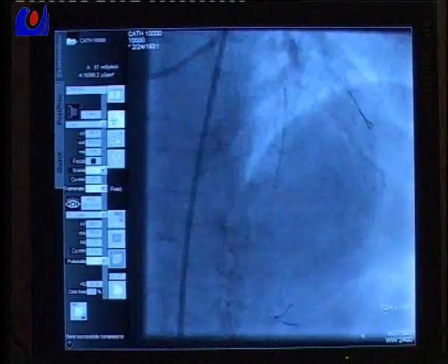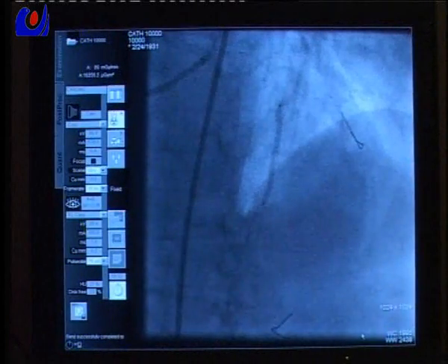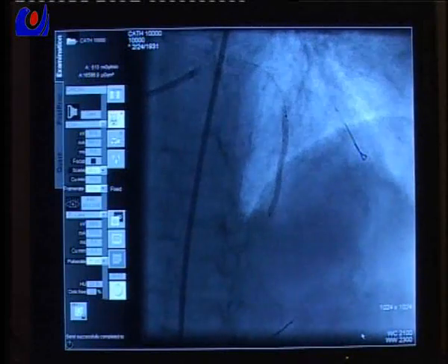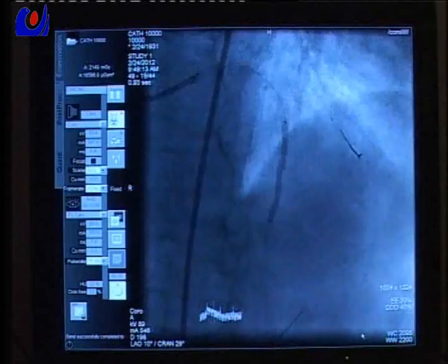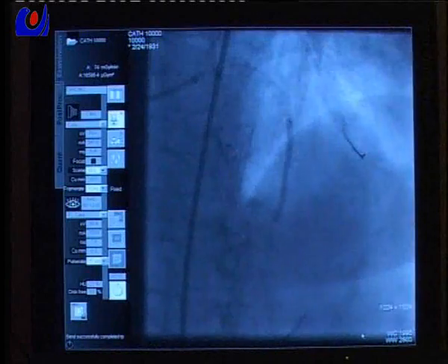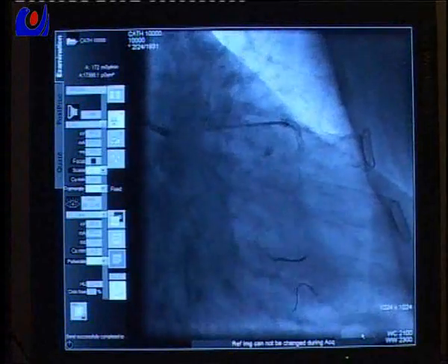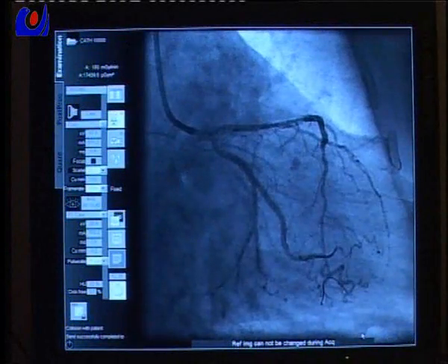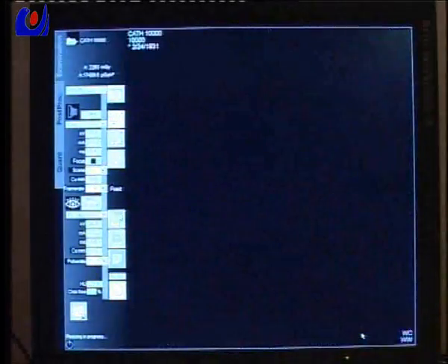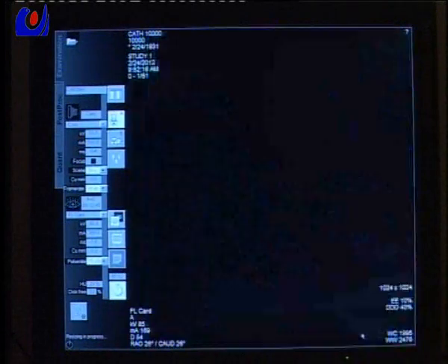Going up, doctor? Yep, 10 ATM, 12 ATM, go to 14. 14 ATM. So pulling back. Okay, cine. Okay, we are overlapping. Okay, good. Yeah, here. All right, 16 ATM. Okay, 18. 18 ATM, all right, perfect.